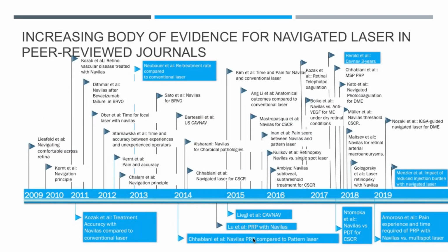Now, there is an increasing body of evidence, based on published manuscripts in peer-reviewed journals, of the use and usefulness of this navigation technology for retinal application, with the first publication of Ben Liesfeld, who grounded the engineering basis for this technology, and then further on with clinical application in various retinovascular diseases such as diabetic retinopathy, diabetic macular edema, vein occlusions, central serous retinopathy, and others, in which the authors were reporting on clinical outcomes, on safety, on accuracy of treatment, on pain and comfort during the treatments.